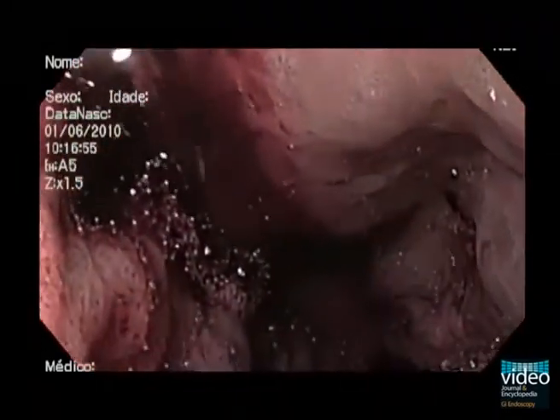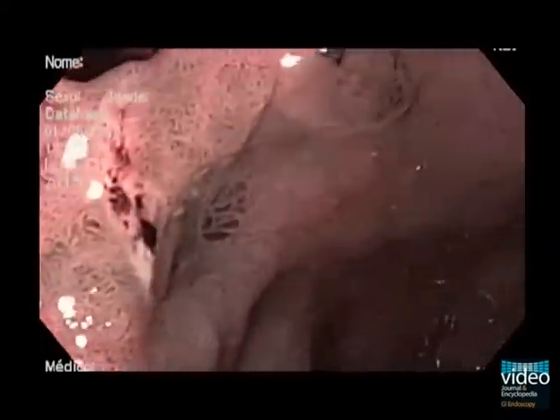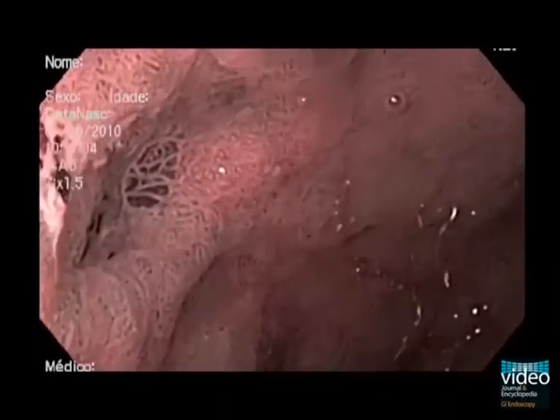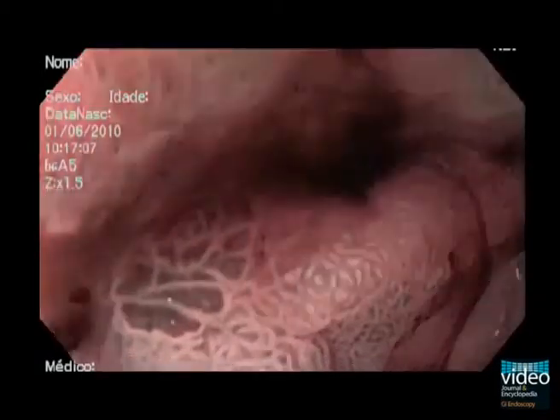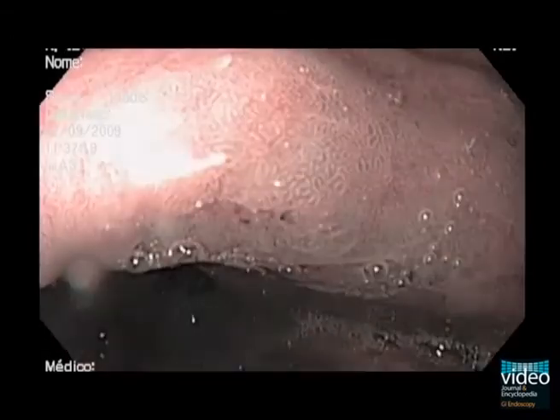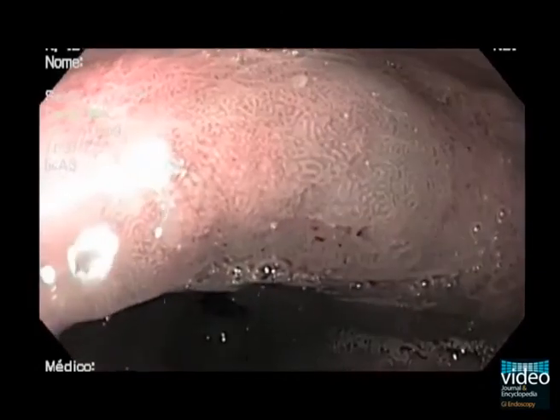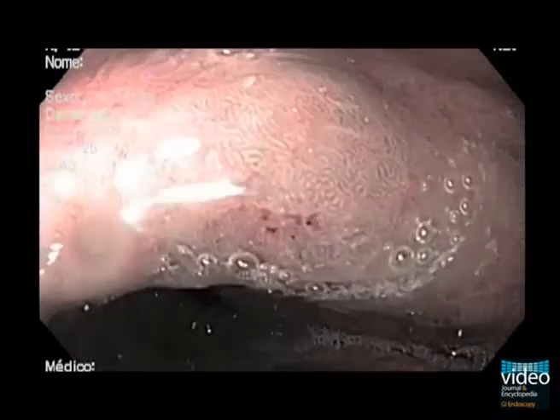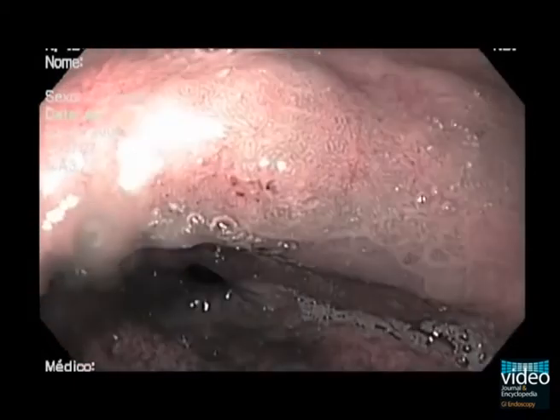Blood is the worst enemy of NBI. After biopsy, wash as necessary to obtain clear visualization of the suspicious areas being biopsied. For better visualization, use the biopsy forceps to bring the mucosa close to the scope. When normal areas alternate with areas suspicious of metaplasia, use NBI to target pre-neoplastic metaplasia areas. This is even more important when you have small areas of pattern C suspicious of dysplasia — use NBI to avoid missing an important diagnosis.